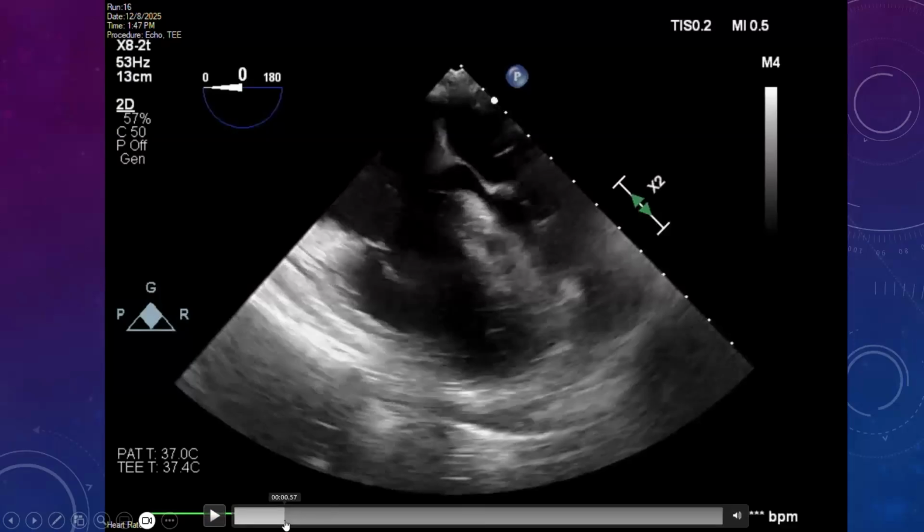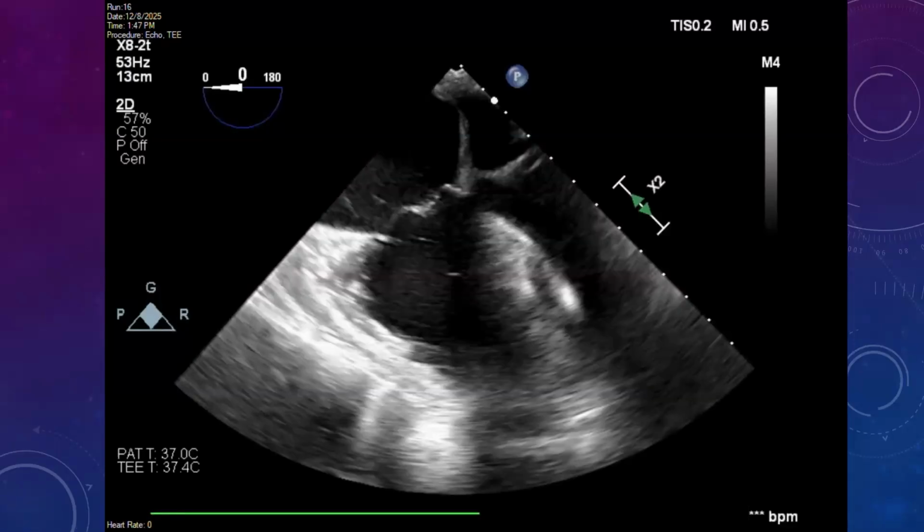Okay, cool. So this is a woman in her 60s, didn't really see doctors, who came in following a cut on her toe. And this cut got infected and it wasn't getting better. Well, she didn't see doctors. Turns out her A1C was 14, right? And she also came in DKA. It was managed. She got a guillotine amputation, unfortunately, 5 days before I met her. She was coming to the operating room for a formalization of her guillotine amputation with vascular surgery.